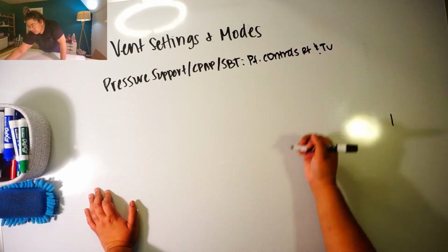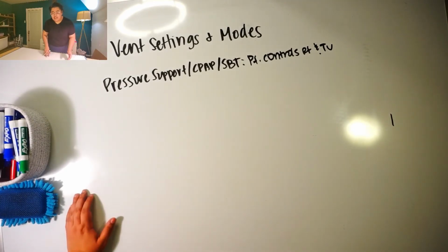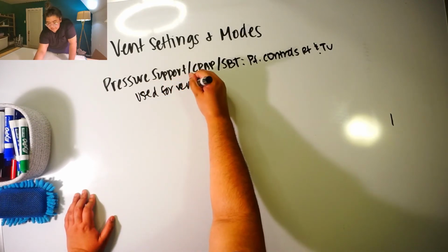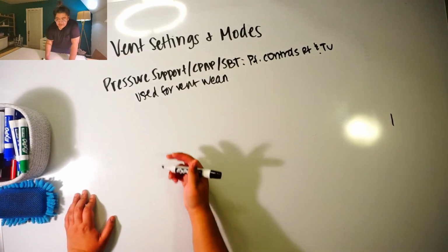Okay, basically in this mode, the patient controls the rate and the tidal volume. So they're pulling however much air they want, however fast they want. Okay, so this is used for weaning, and we're going to talk more about vent weaning in another video.